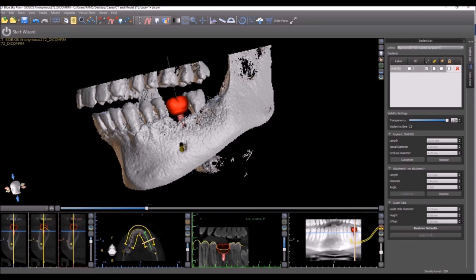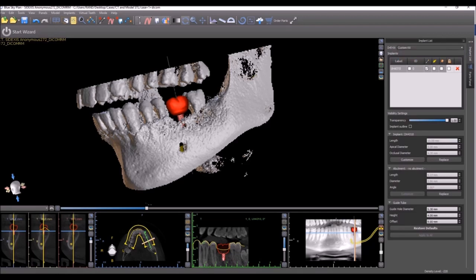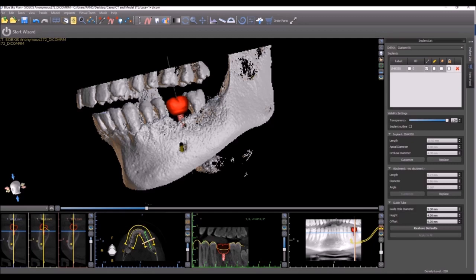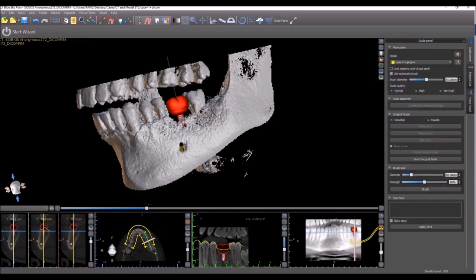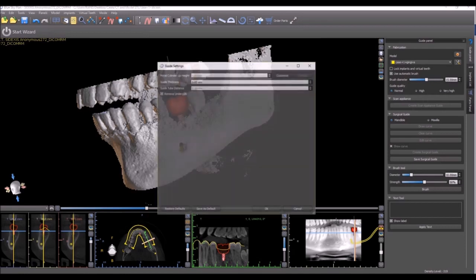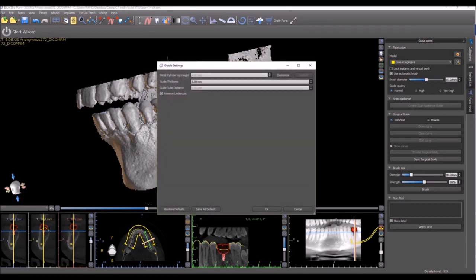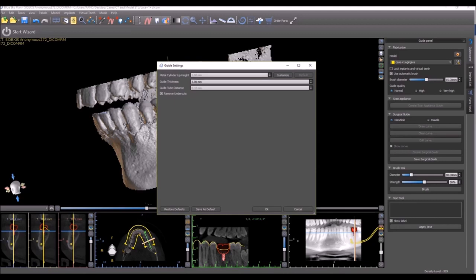A user that's not using either one of those kits should choose the custom kit option. Now, they could go ahead and enter the numbers and the data for the guide hole diameter, height, and offset to accommodate any metal cylinder for any guided surgical kit. The same is true when we go to the guide panel and look at the settings for the surgical guide. The information regarding the metal cylinder or lip height is dependent on which guided surgical kit is being used. And, of course, it could be edited and customized on a by-need basis.